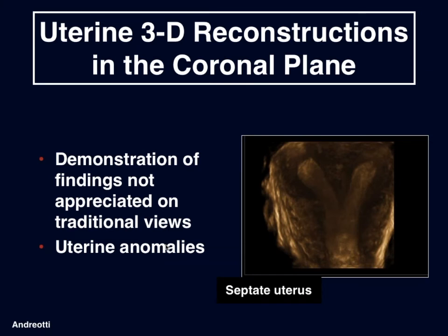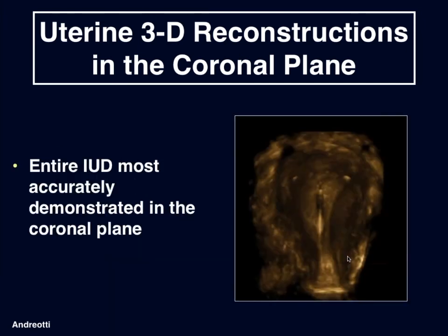Uterine anomalies, IUD location, and other abnormalities associated with the endometrial cavity can be better evaluated in the coronal plane because there are findings not appreciated on traditional views. We can nicely demonstrate a septate uterus in the coronal plane, and we would not be able to demonstrate this diagnostically using 2D imaging. Here we can see in the coronal plane an IUD normally located within the endometrial cavity — the arms within the fundal cavity, the shaft within the mid and upper cavity — the entire IUD demonstrated on a single image, which is not possible with 2D imaging.